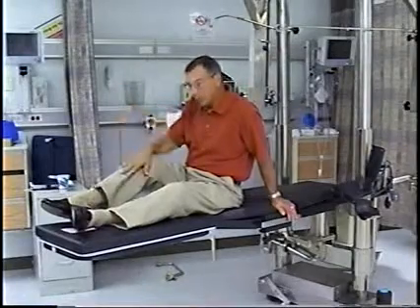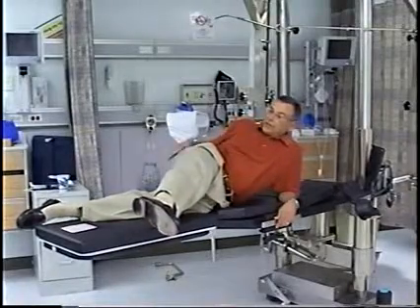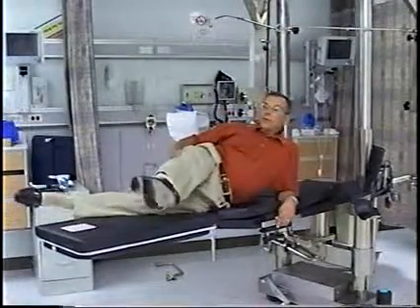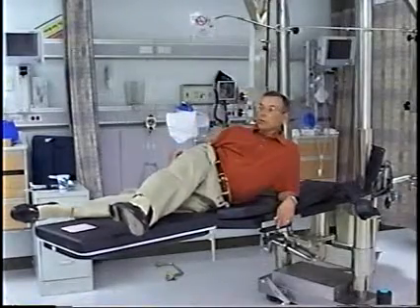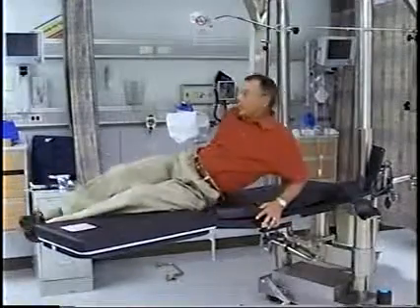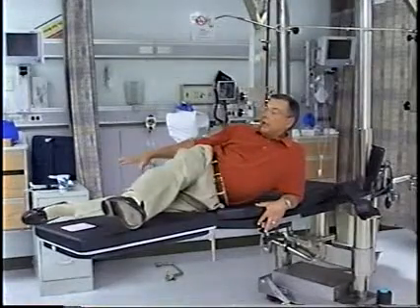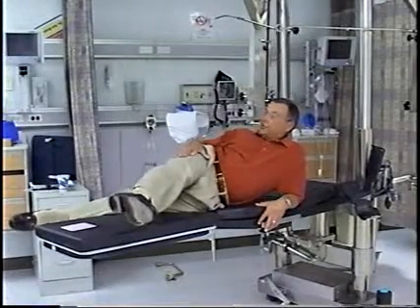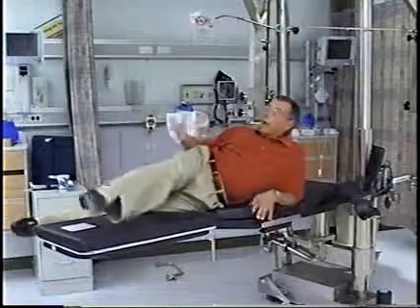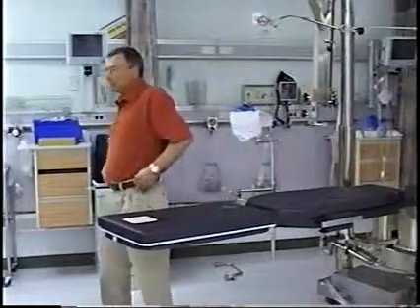and it's called a horizontal perineal post. And the patient is going to be in this configuration, kind of scissored, with a well leg underneath, okay? And the doc is going to come in from this way. And you've got that device here. Traction on both? No. The well leg would be just sitting on a board, and the affected leg would be over the top of that in a scissored position, okay? Most docs are not doing lateral femoral rods anymore. Most of them are strictly doing them supine. But you're right, that happens occasionally.